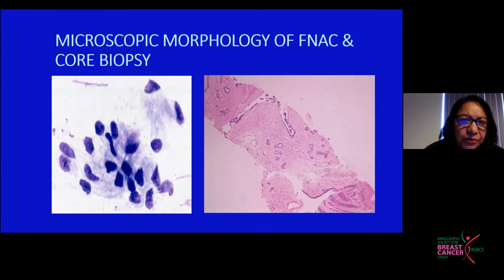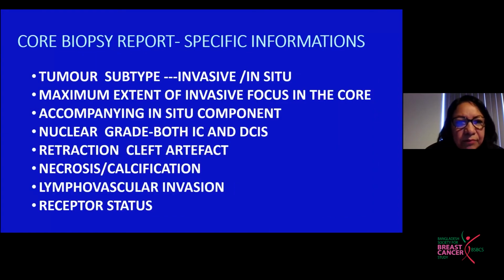So a core biopsy report may include the tumor subtype, whether it is invasive or in situ in type. Even we report the maximum extent of invasive focus in the particular core. And also we note down whether there is any accompanying in situ component or not.